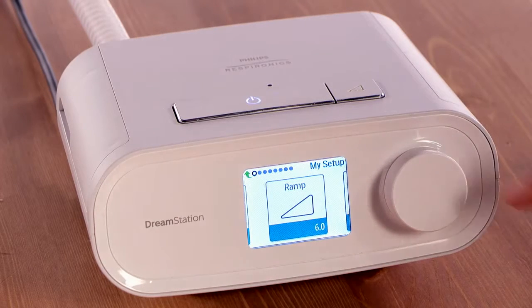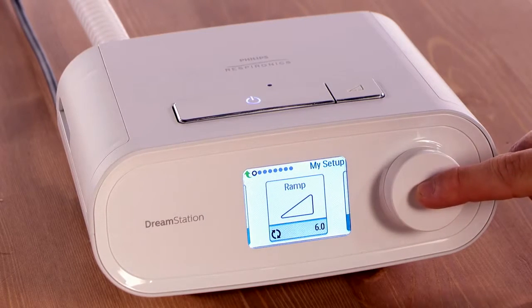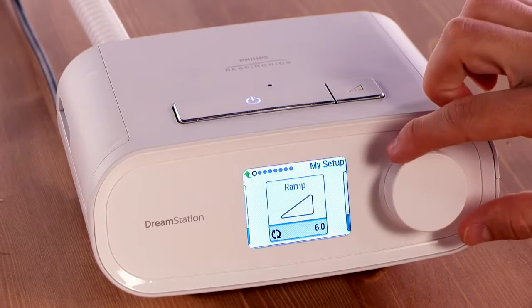Press down on the dial to select the ramp symbol. If you don't see the symbol, ramp is not enabled on your device.